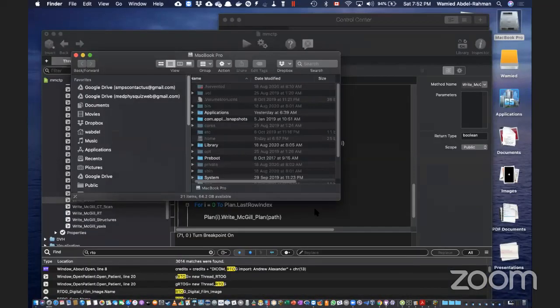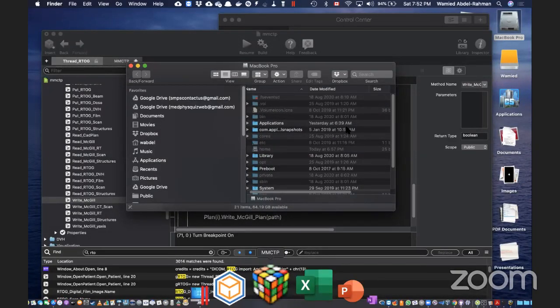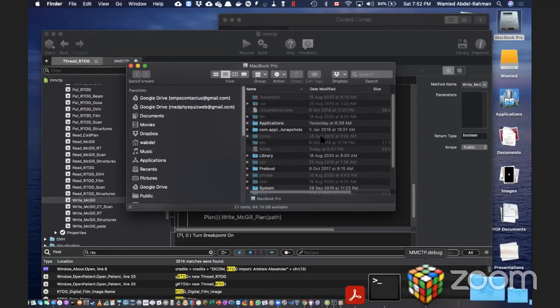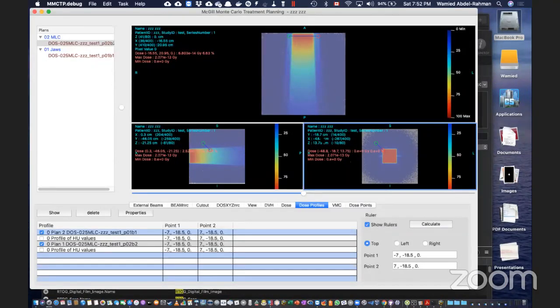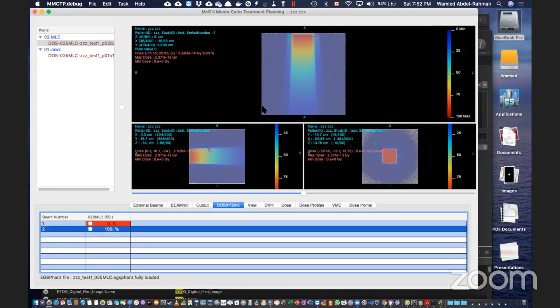you can. So in the end, Wameed, you now have an input file that accurately positions the MLCs. Is that what you've confirmed? Well, I'm tweaking it a little bit. Tweaking it so that the profile now matches the jaw profile? Yes, they have to. So I have to tweak it. I could run this calculation again, because I did a 1 millimeter adjustment. So while we do something else, I can run it. I modified it in the template, so it should be okay.